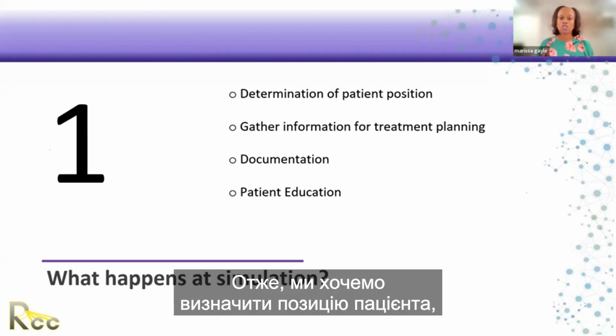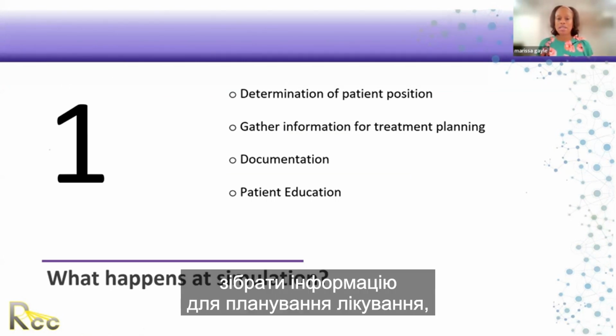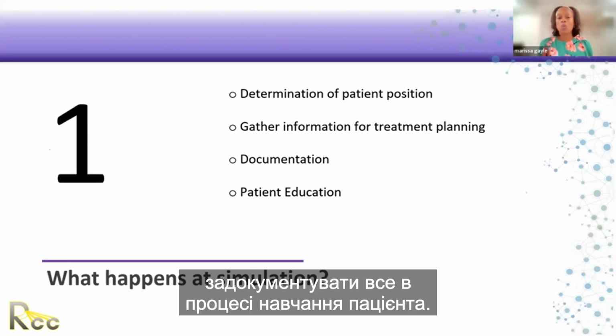So a couple of things. We want to determine the patient position. We want to gather information for treatment planning. We're going to document everything and do patient education.